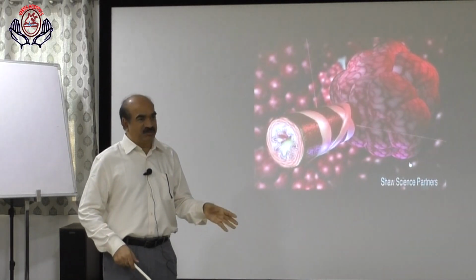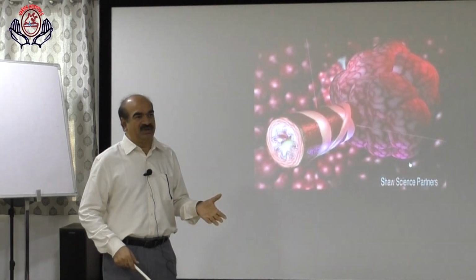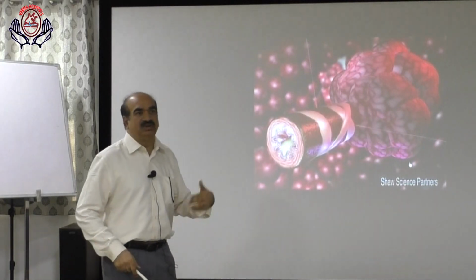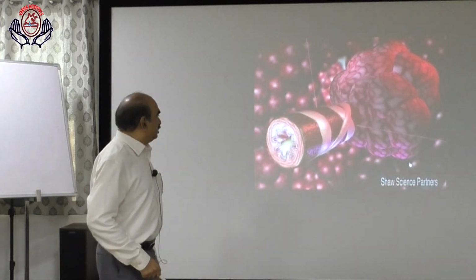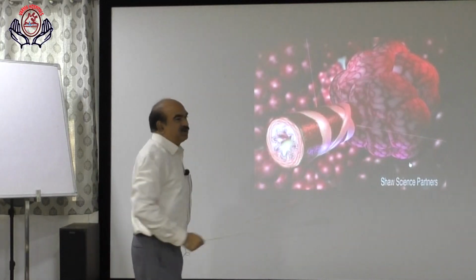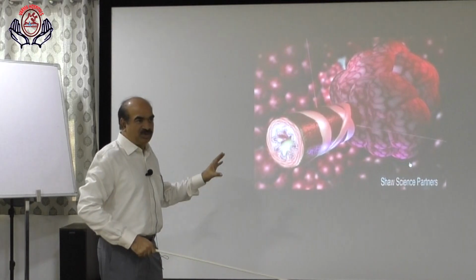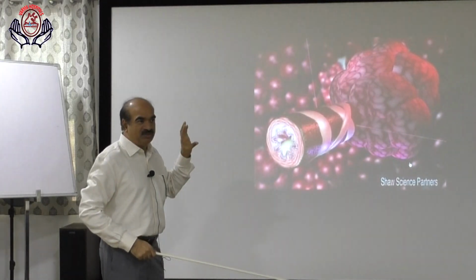That clears edema and there will be recruitment of alveoli. If there is proper recruitment of alveoli, that improves the ventilation perfusion ratio and even intrapulmonary shunting. So in oxygenation failure, we will start with NIV, CPAP, or in ventilatory mode, we will focus mainly on PEEP.